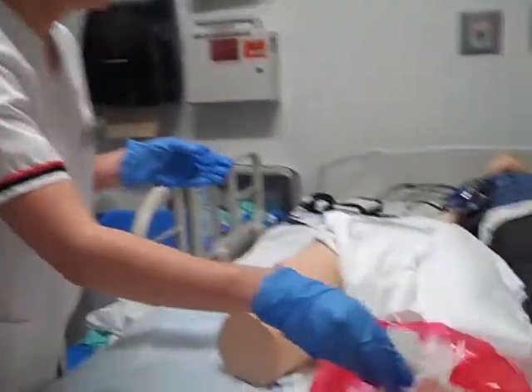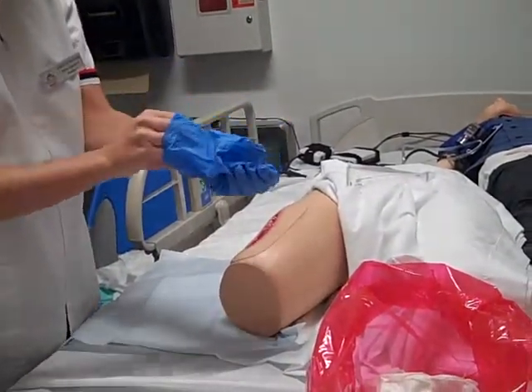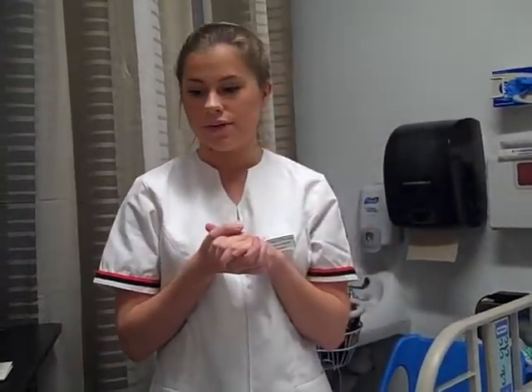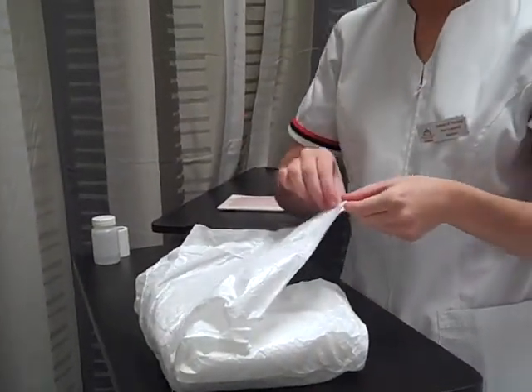I then will dispose of my soiled equipment, and I will perform hand hygiene. Now I am ready to set up my sterile field above waist level.